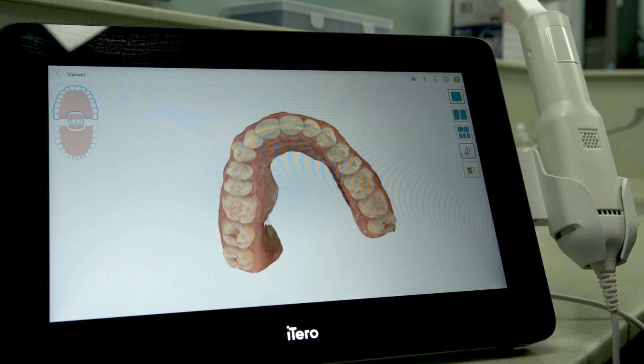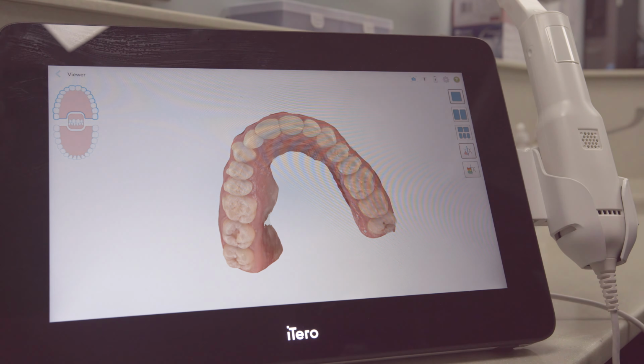You log on to My Itero the same way as you log onto the scanner, but obviously on the computer. And when you go onto My Itero, you'll have all of the annotations for the patient, and you can create a report which you can email to them.